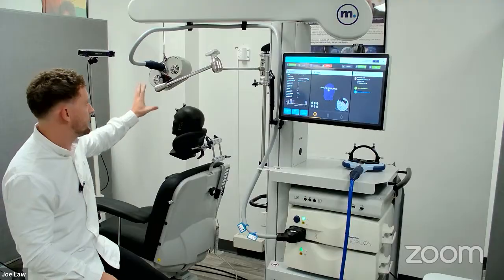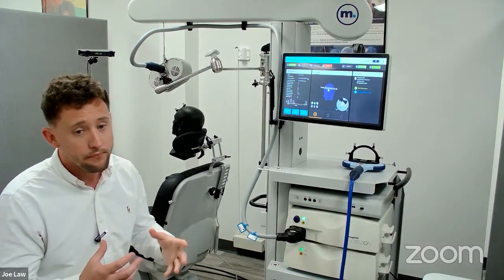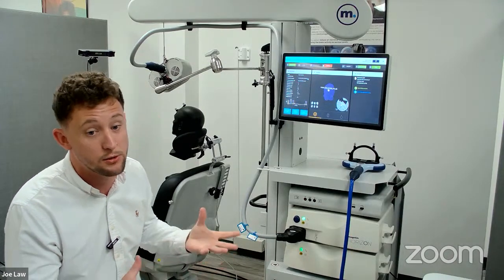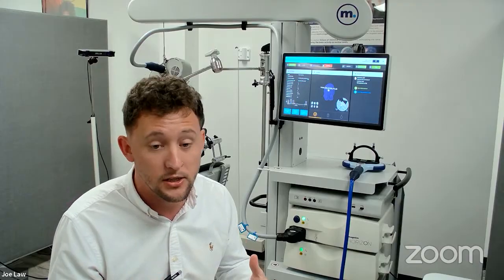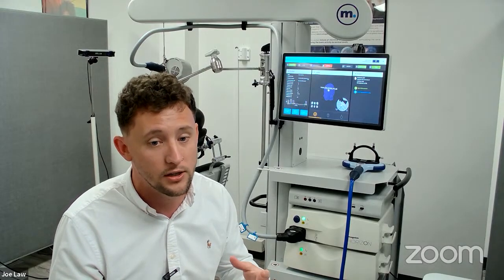I don't even think you can hear them at the minute because they are quite quiet. The way they work is an algorithm. The more you run that system, and if that coil does heat up, it'll make sure it doesn't overheat by the fans going quicker. The hotter it gets, it wants to make sure that your treatment is not interrupted. So those fans will spin as fast as they need to make sure that coil is cooled.